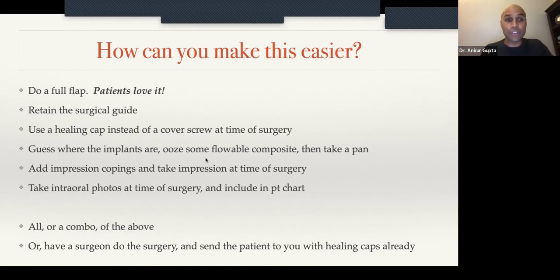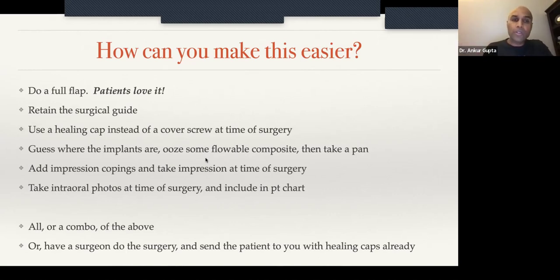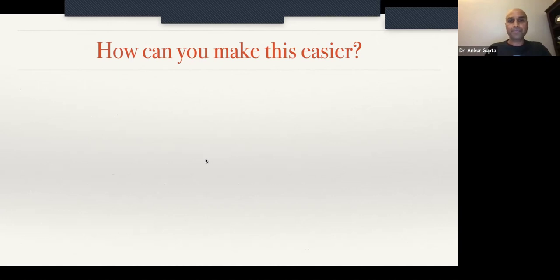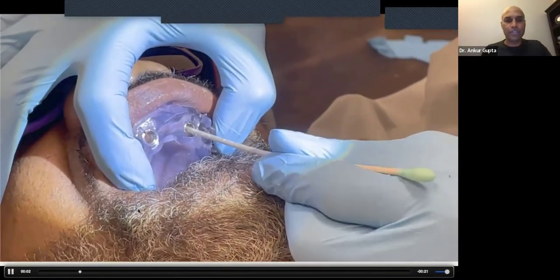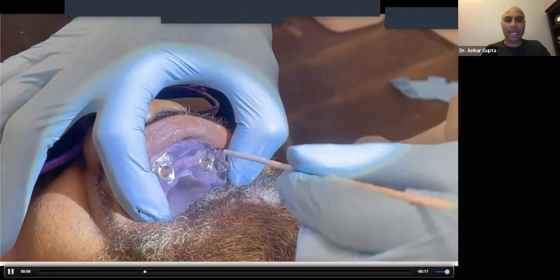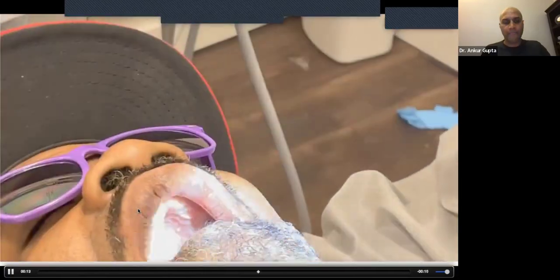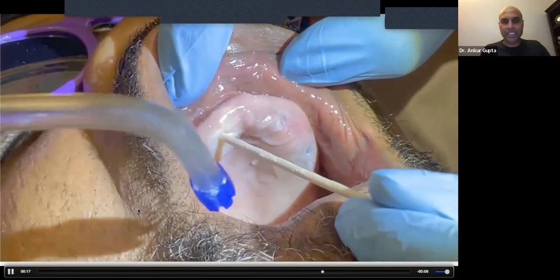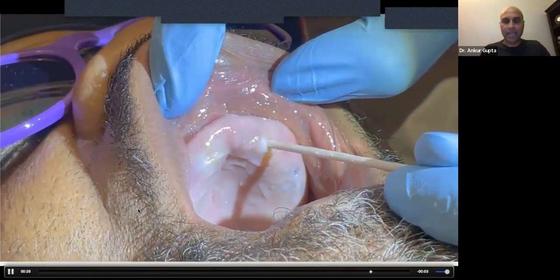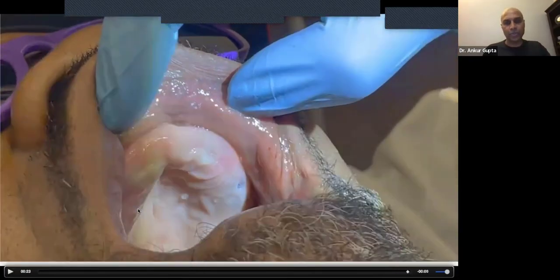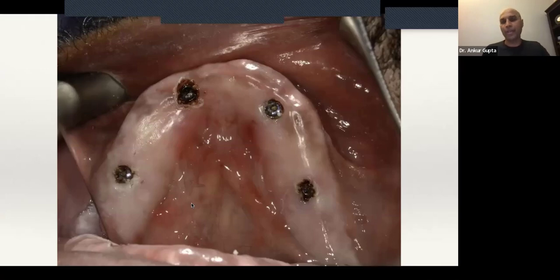This is where you should retain the surgical guide. Remember that surgical guide you used? Go find it. Wipe off the clotted blood and stick it back in. I had no idea where two anterior implants were, so I stuck the surgical guide back on, used a Q-tip to find the center of each guide sleeve, and that's where I aimed when I started cutting away tissue to look for those implants. It worked out really well — I cut away just enough tissue to find them.